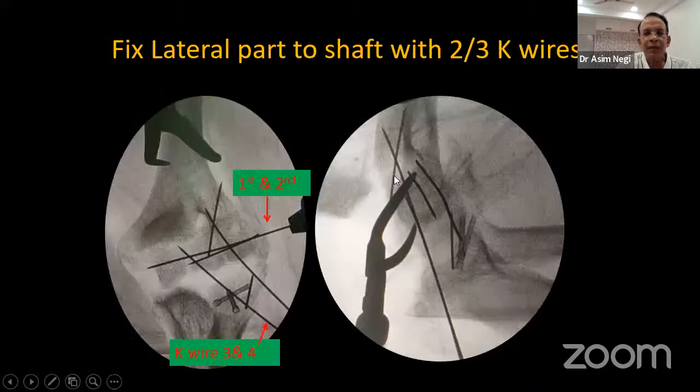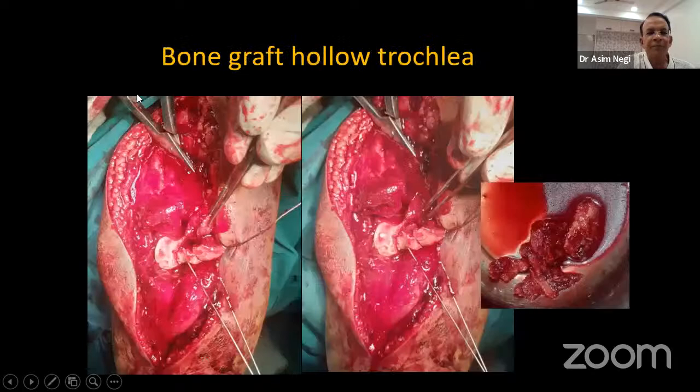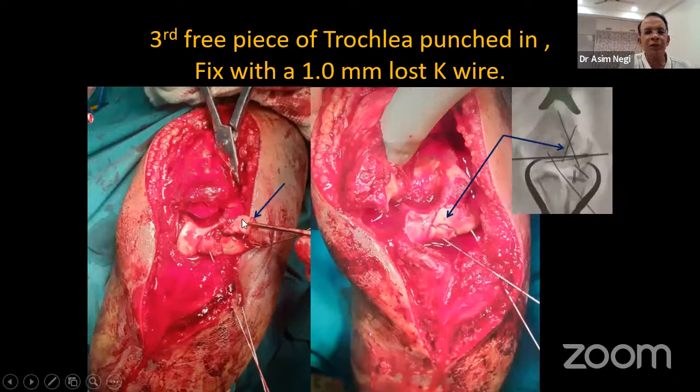So these were wire number 1 and 2. Then these were wire number 3 and 4. And these are 3 and 4, fixing the trochlea to the metaphysis there. This trochlea was crushed. So much of the cancellous graft from the anterior crest could be filled into this, packed into this. Then there was a small third piece of trochlea which was kept on the table. So this comes and sits into this place.